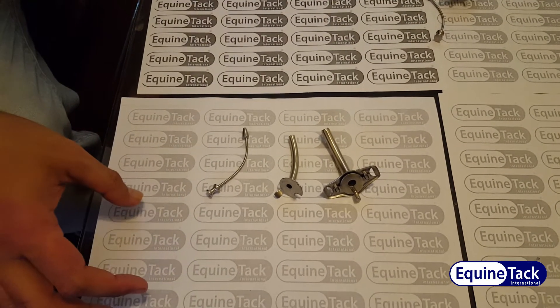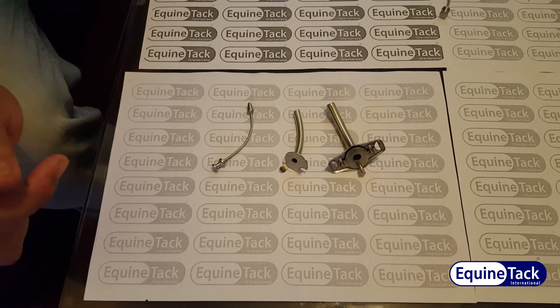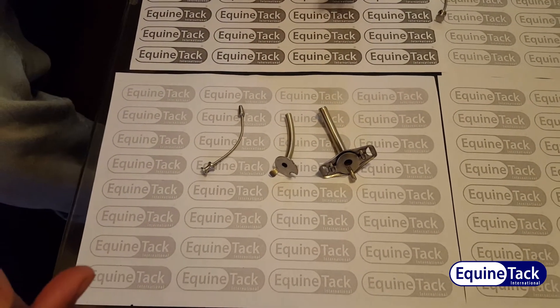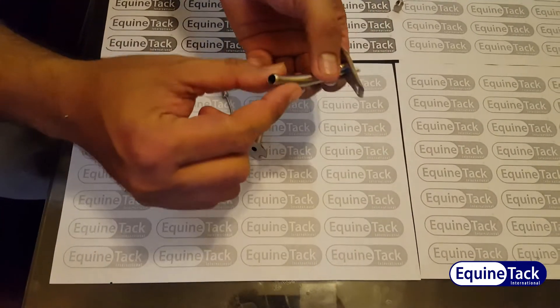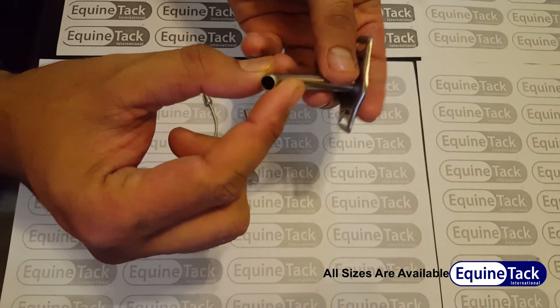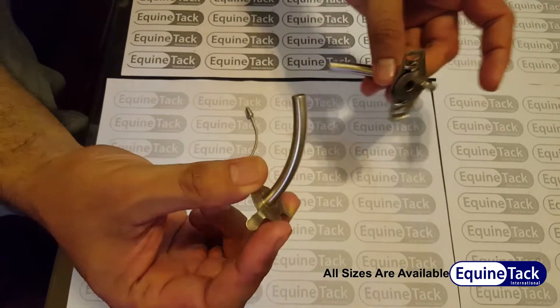Hi, I am from Equine Tack International. We are a manufacturer of surgical and dental instruments in Pakistan. I would like to show you the tracheotomy tube. This tracheotomy tube consists of three parts. This is the outer cannula — as you can see, it is a hollow tube, size 8mm.